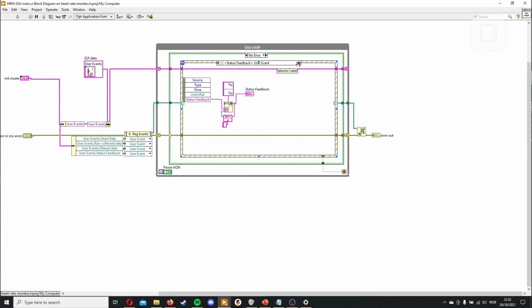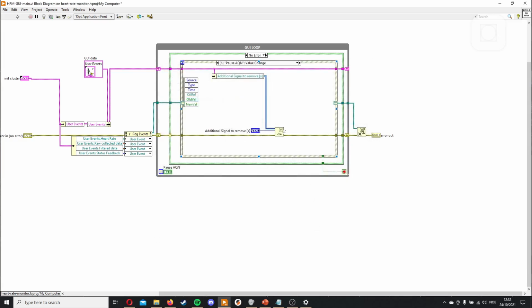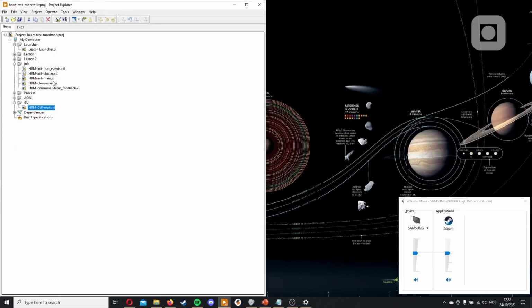Now let's make a new user event for this. And since we're lazy, we'll just duplicate this one. Choose the new button here. Remove this duplicated button and change the user event. There you go. Now we're done on the GUI side. We need to go into the acquisition.